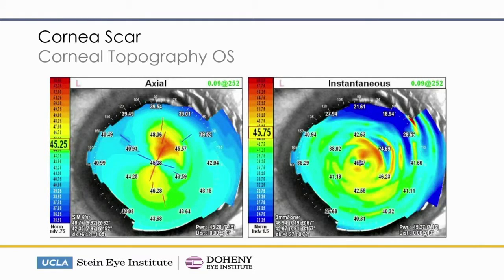Is this patient a candidate for a toric? Possibly. It depends obviously on the topographic image that you're looking at, and also depends on the chance that this disease will recur. In this patient, I would say I'd probably not consider a toric unless they had not had a recurrence of their keratitis for many years.